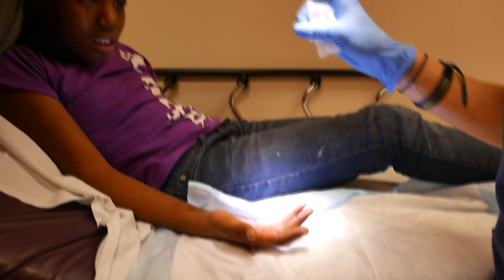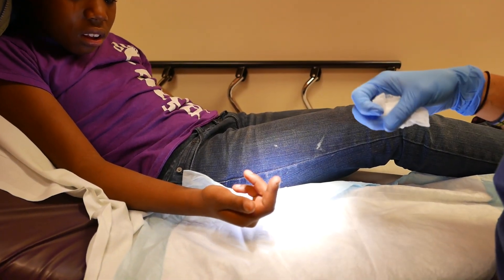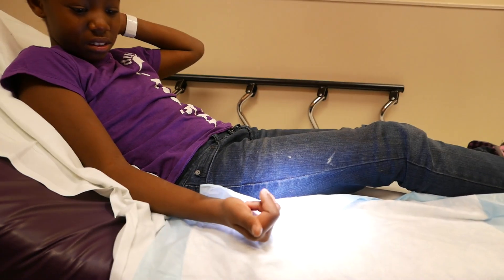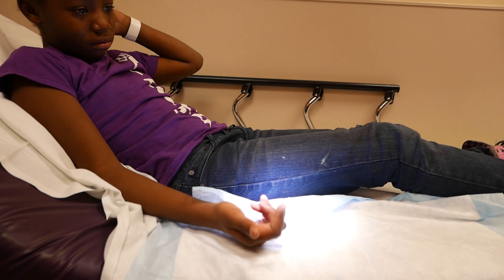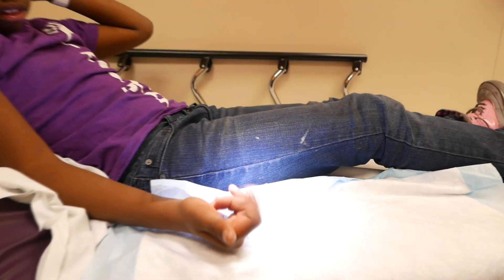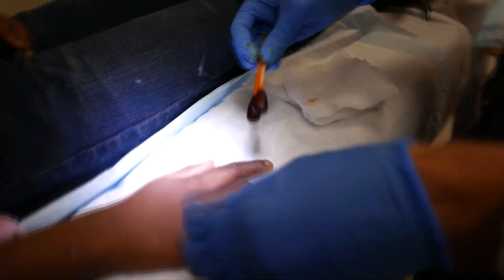It's real big. So I want you to start doing this, okay? The medicine's gonna move all the way to the tip of your finger — stop rocking it back and forth, like this. I think you're gonna be a great YouTube star. Just keep moving it, okay? Go ahead, put your finger flat, just like that, okay? Just gonna clean it one more time.